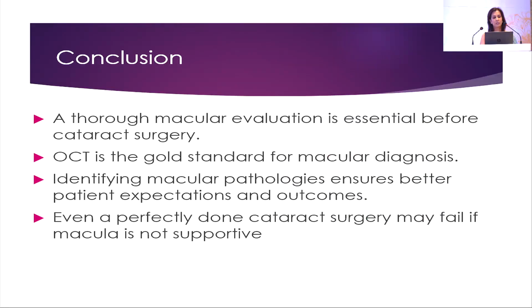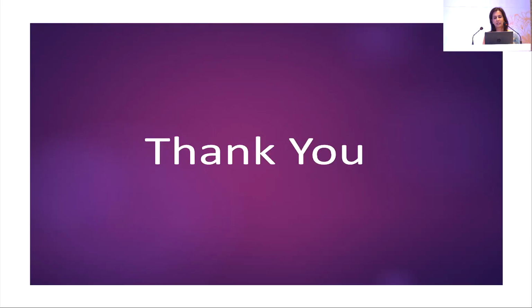So to conclude, a thorough macular evaluation is essential before cataract surgery. OCT is the gold standard for diagnosis. Identifying macular pathologies ensures better patient expectations and outcome. And even a perfectly done cataract surgery may fail if the macula is not supportive. Thank you very much for your time.